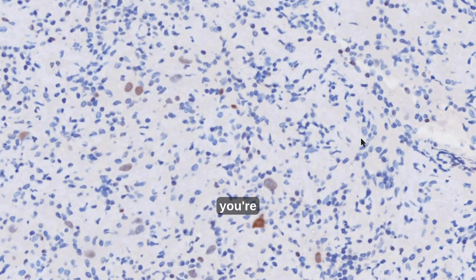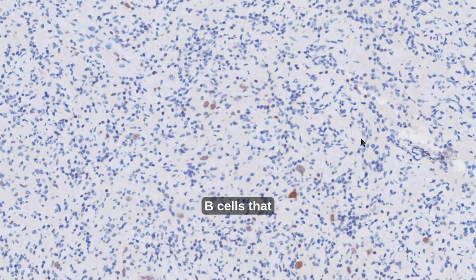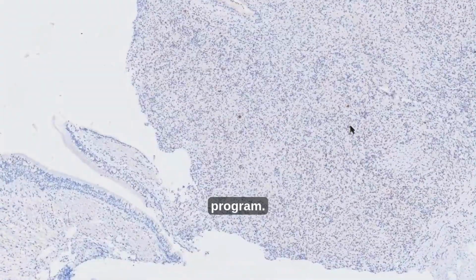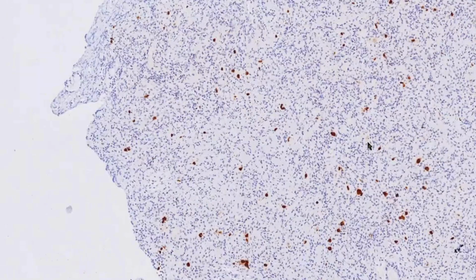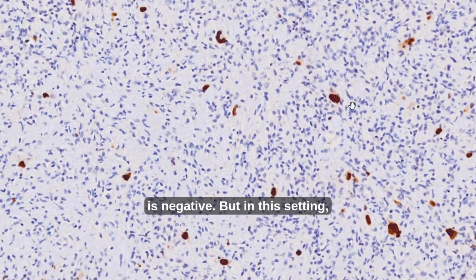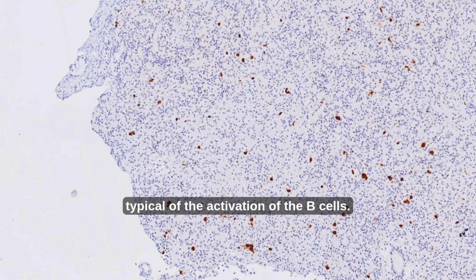when you're dealing with B cells that have the complete B cell program. BOB1, in this case, that is very useful. There's also a transcription factor that is negative, but in this setting, this is MUM1, typical of the activation of the B cells.